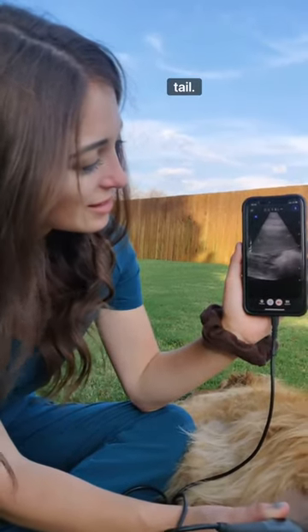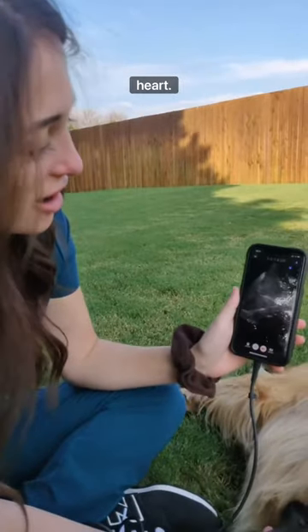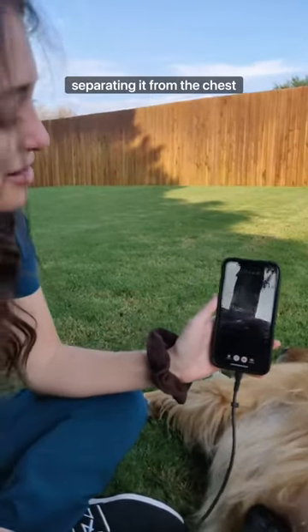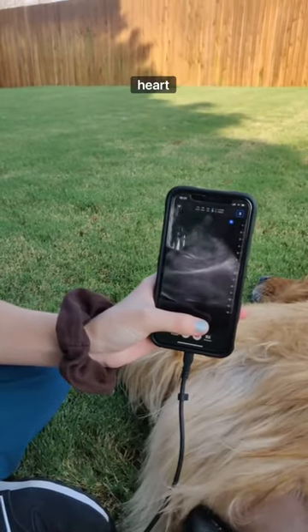Oh, I saw the whale tail — one of the views we use to look at the liver and heart. This right here is the liver, and that one really bright line right there is the diaphragm, and that's separating it from the chest cavity. And on the other side of that line you can see the heart beating.